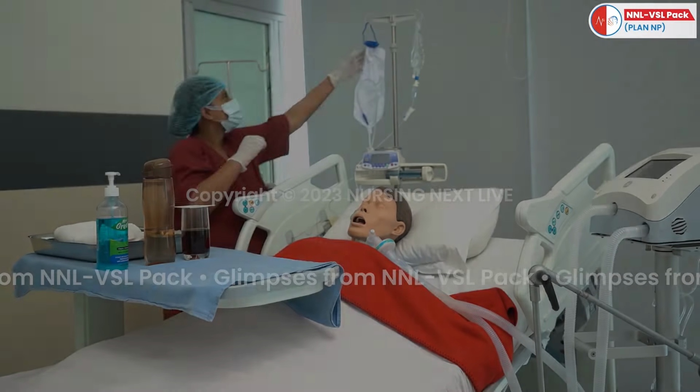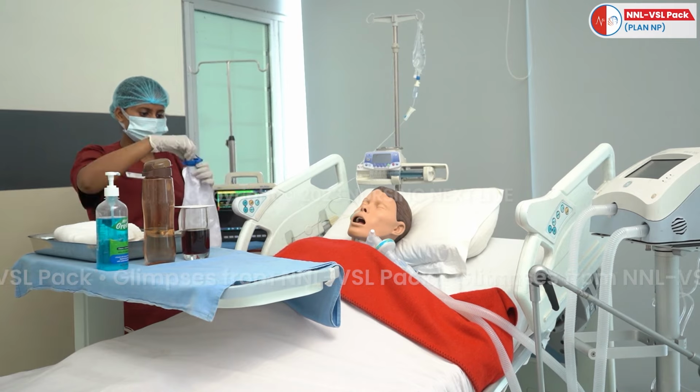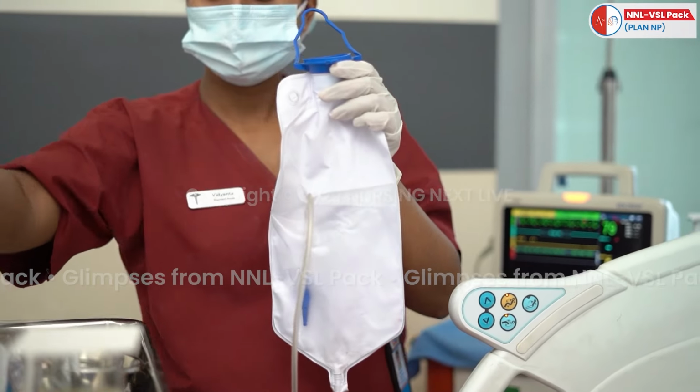Now, we will see the demonstration of continuous nasogastric tube feeding. The purpose, indication, and initial steps of the procedure will remain the same. Instead of using a 50 cc syringe, a gravity bag will be used to feed the patient. Fill the gravity bag with an appropriate amount of water required to clean the bag.